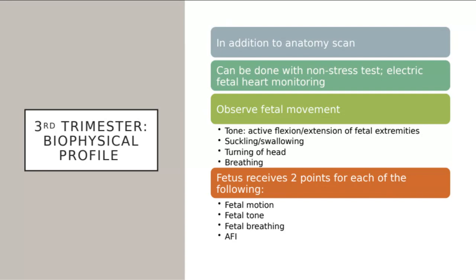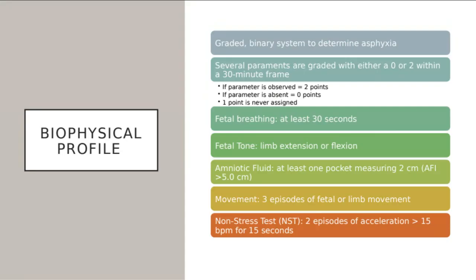So we need to make sure that the fluid levels are indicating that the baby is actually suckling, swallowing, and the kidneys are functioning properly. Now, depending on how the baby does during this evaluation, we are going to take different plans of action. So a biophysical profile is basically a graded system to help us determine asphyxia.